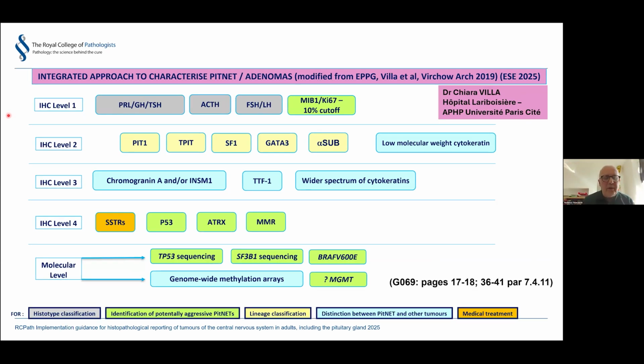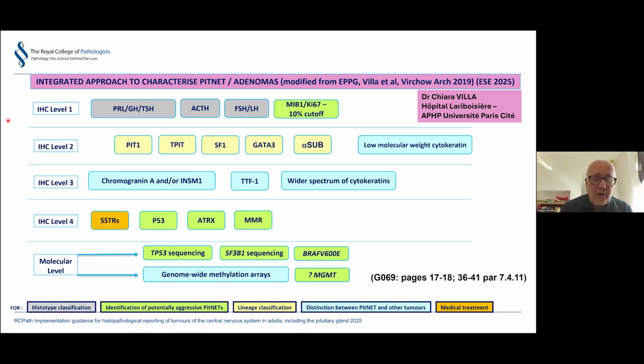The field of pituitary pathology is way back in the integration of molecular and pathological data. So we decided on recommending a wide panel to classify pituitary tumors, as immunohistochemistry is the cornerstone of the classification. We can call them PIT-NET or adenomas. Of course, everybody has different financial pressures. People, in particular in the US, tend to apply a reduced panel.